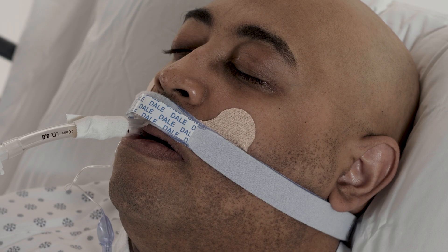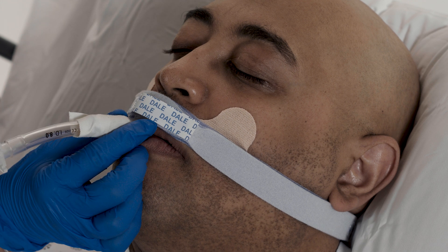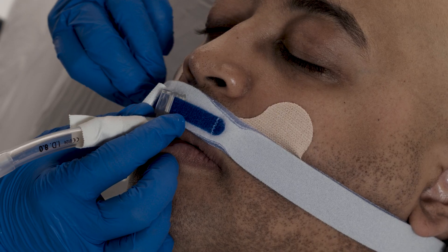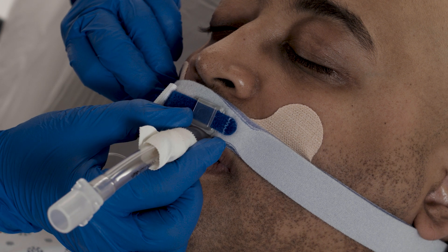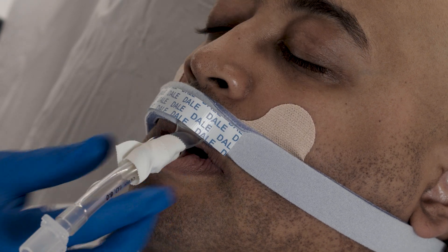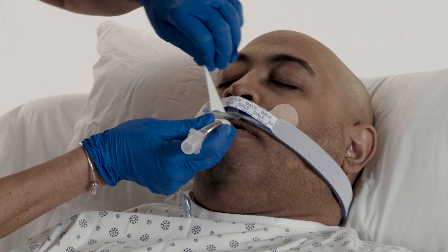To reposition the tube in the patient's mouth, hold the taped channel with one hand. Lift the Dale Overlay off the track. Slide the channel to move the ET tube to the desired location. Press the overlay back down onto the track and neckband to secure the tube position in place. Change tape as necessary.